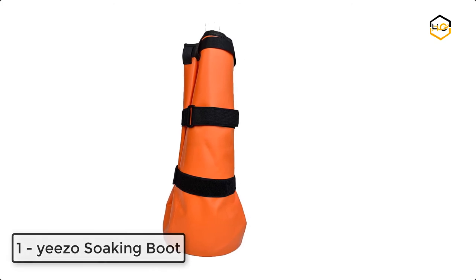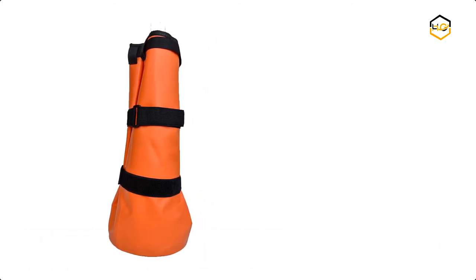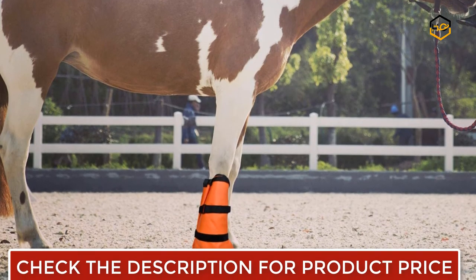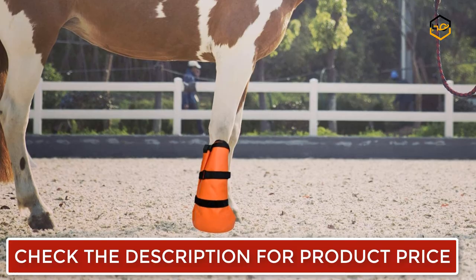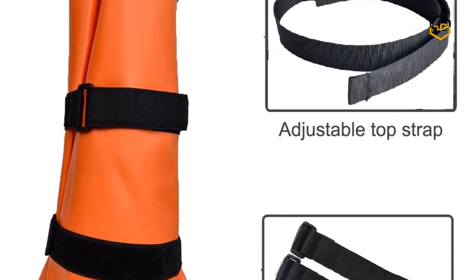At number 1, we have the Yeezo Soaking Boot. The horse hoof soaking bag is essential for horse hoof health. The durable, reusable, heavy duty plastic soaking bag can be used for hoof soaking and conditioning treatment for puncture wounds, thrush or bacterial infections. Each boot comes with an elastic band and 1 EVA foam pad.